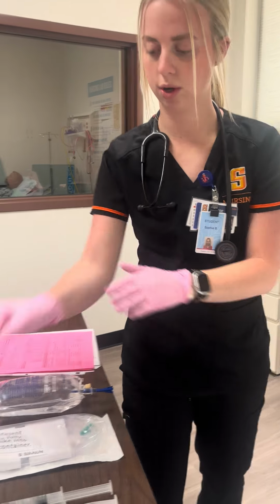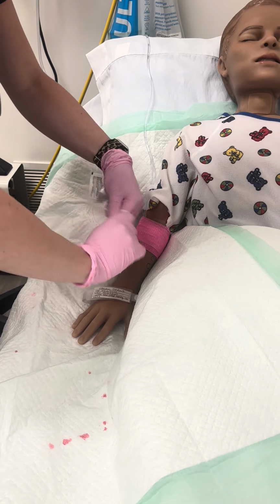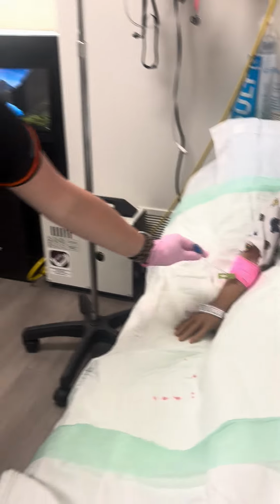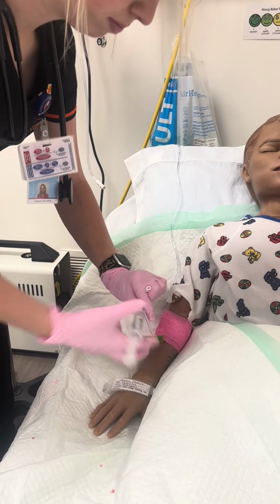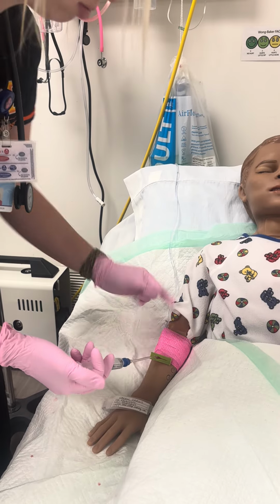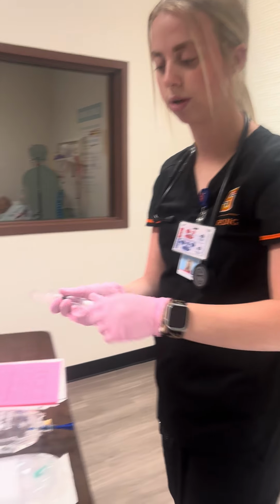So first I'm going to check that our line is patent. So this is our line. I'm going to just clean it really vigorously with friction for 30 seconds. For sake of time, that was 30 seconds. And I'm going to hook up our saline and just unclamp and flush. The line is moving great and it's patent, so we'll clamp that back off and we'll set that down and I'll re-clean again before we start the transfusion.